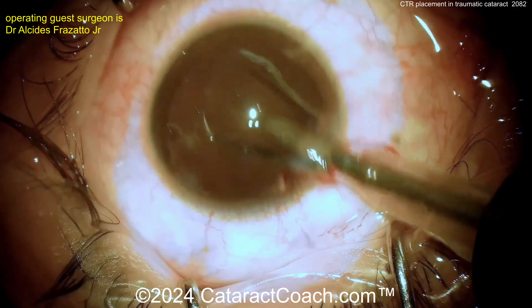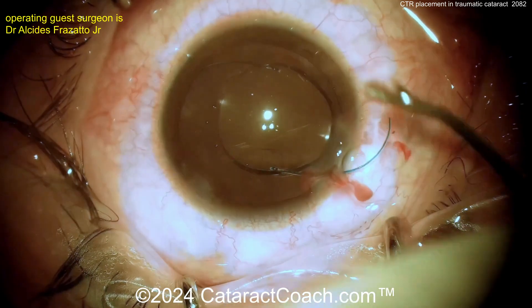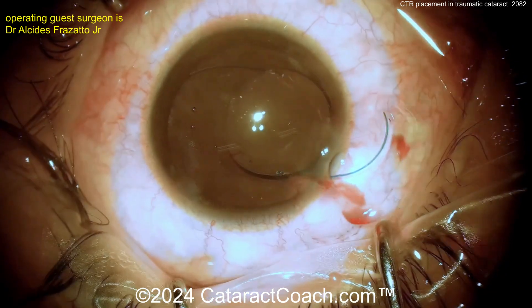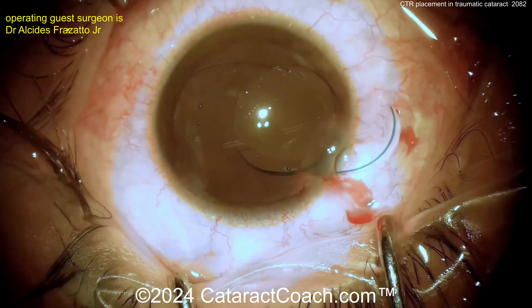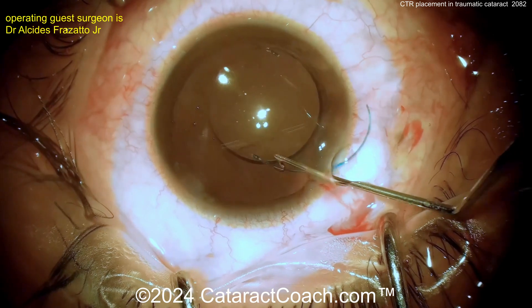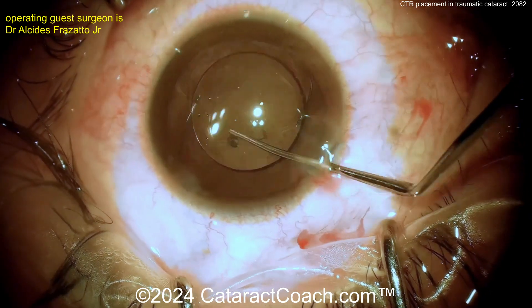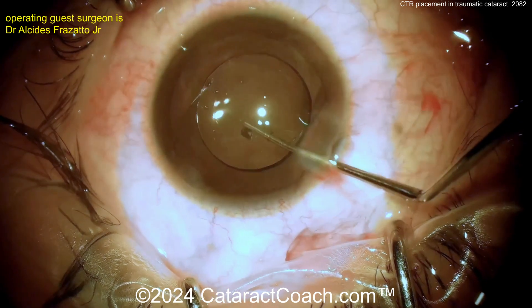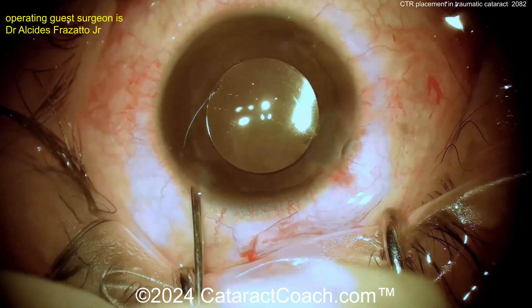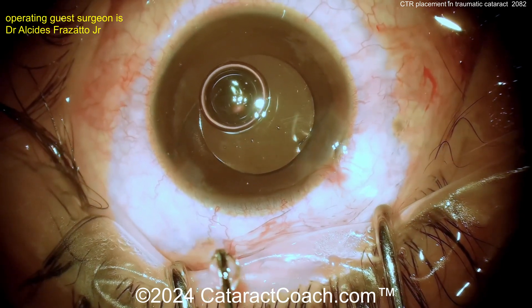Here comes the lens. I like the idea of putting a three-piece lens here because there are going to be more options for placement. In this situation, you may want to place the haptics in the sulcus and then get the optic capture through the rhexis — that may be a great option as well. Dialing that in — is it sulcus with optic capture? In fact, I think that is what we've got there. Correct me if I'm wrong, but that's a great option.